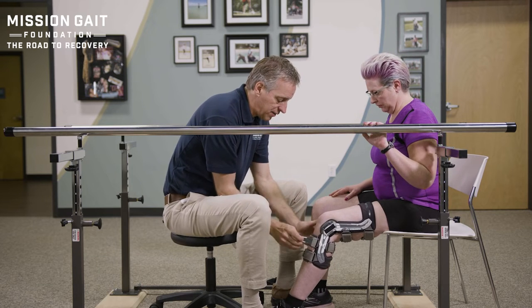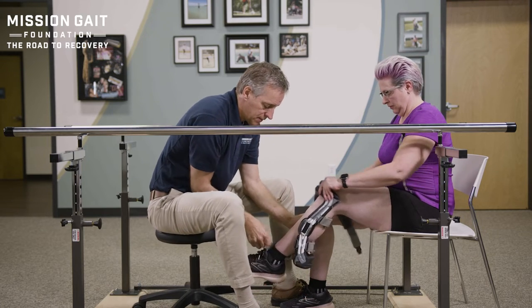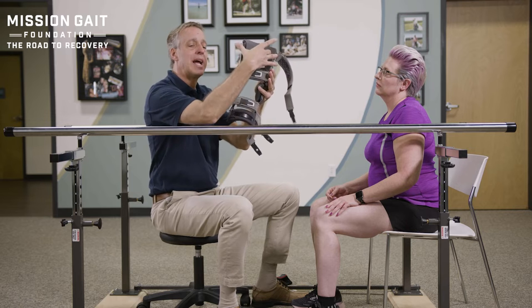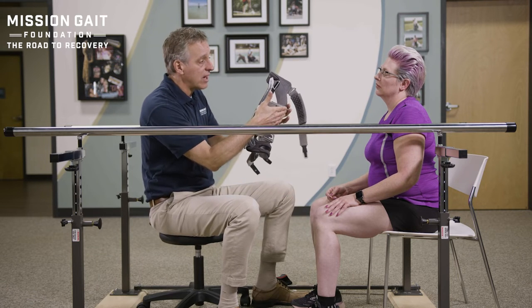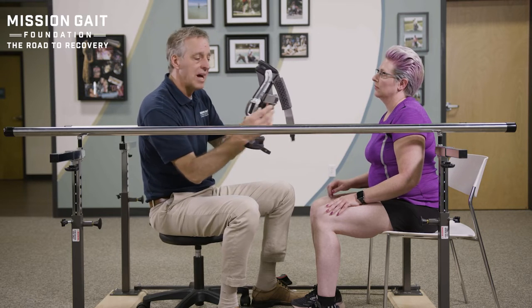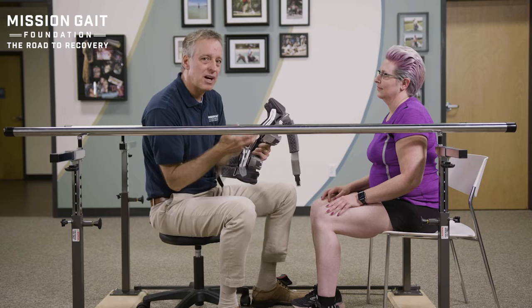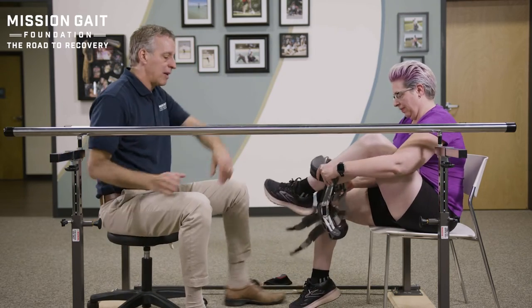Next, we're going to take the brace off completely and have Sarah put it on herself, because it is a bit tricky when you're doing it at home. Before they leave, I want them to do it themselves. Notice in her case — she's been trained — she knows to pull it up nice and high. She puts on the bottom strap first; top or bottom doesn't make a big difference, but that's what works for her. These two back straps stabilize so the brace can't come too far forward. Then she comes to the front and gives it a good snug — that strap she pulls a little tighter than any other, giving her the most stabilization.